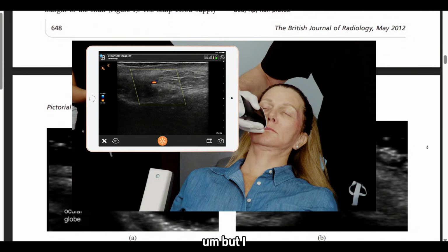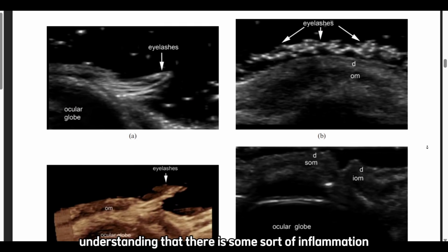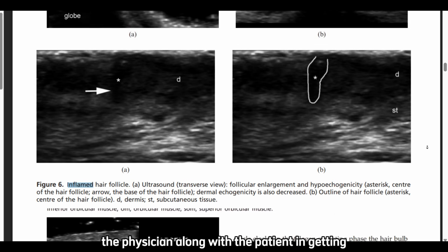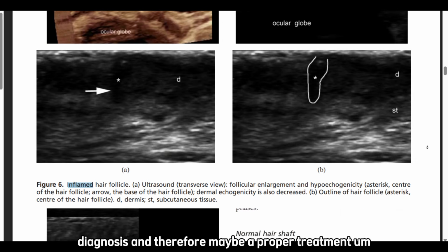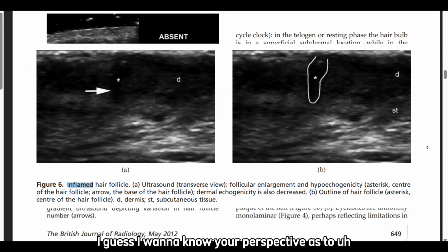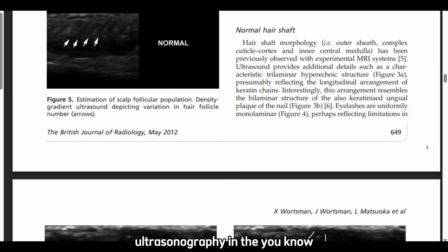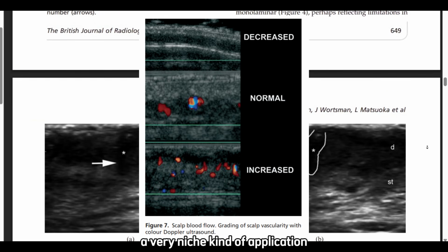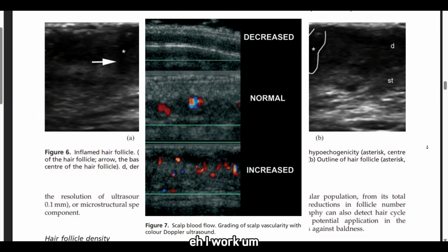But I still think having an understanding that there is some sort of inflammation, and where that inflammation is occurring, would be important to the physician along with the patient in getting a proper diagnosis and therefore maybe a proper treatment. I want to know your perspective as to whether this is a common thing to use ultrasonography for in the clinical setting when examining a patient, or is it a very niche application?